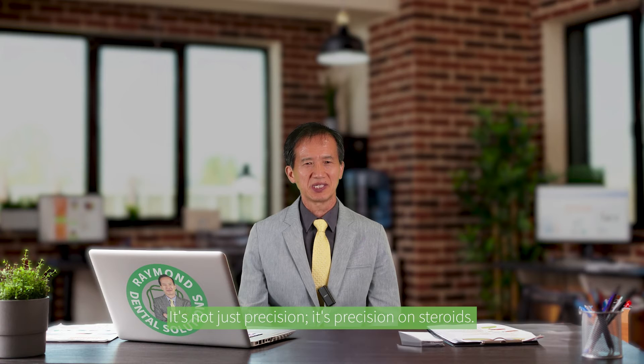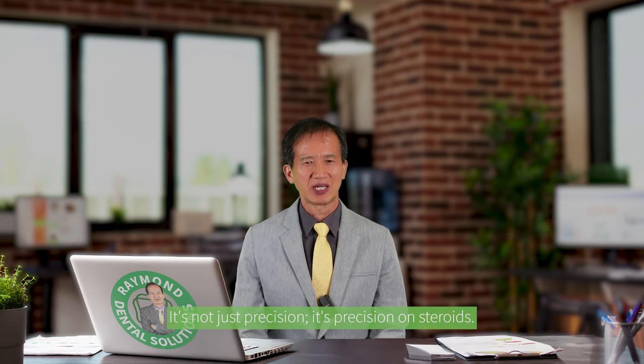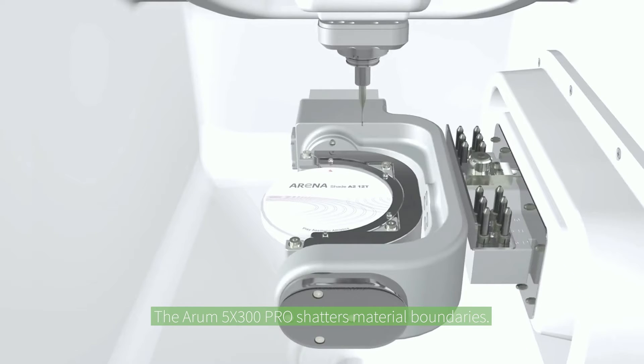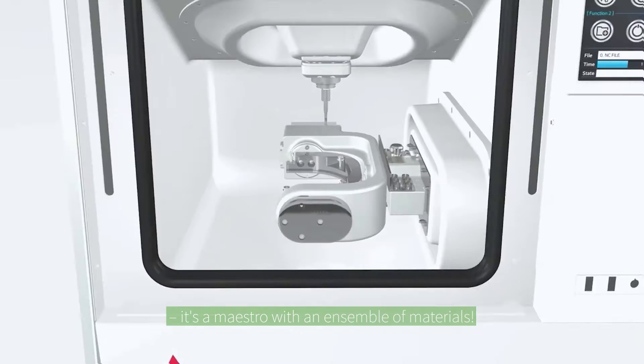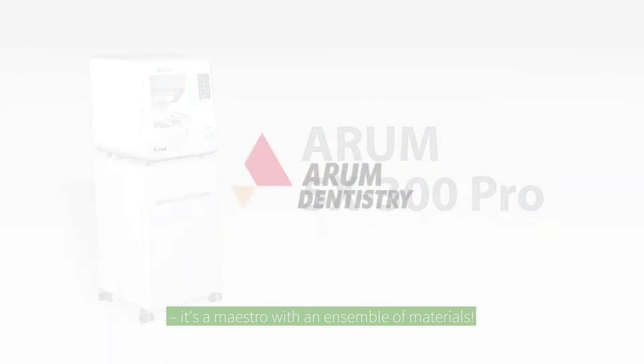It's not just precision — it's precision on steroids. The Arum 5X300 Pro shatters material boundaries: zirconia, PMMA, PEEK, lithium disilicate, nano composite, wax. It's a maestro with an ensemble of materials.